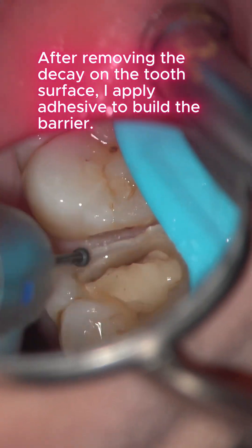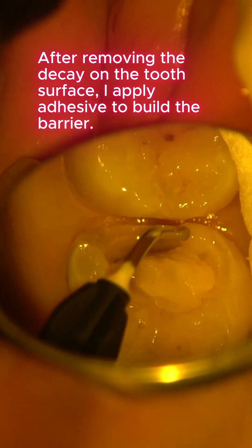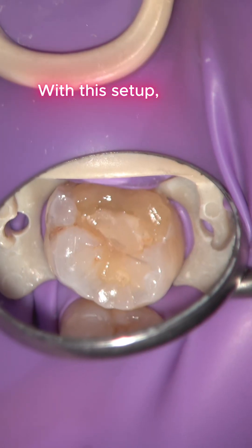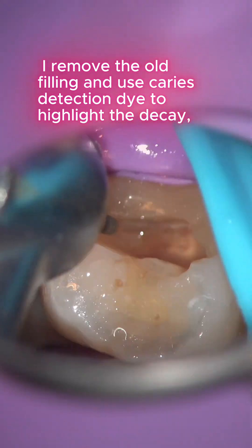After removing the decay on the tooth surface, I apply adhesive to build the barrier. This allows us to place the rubber dam sheet. With this setup, I remove the old filling and use caries detection dye to highlight the decay.